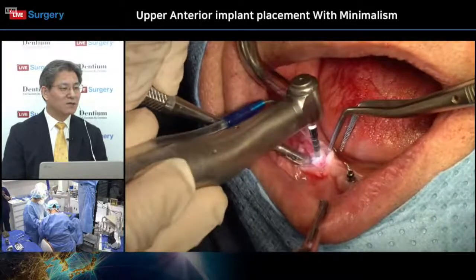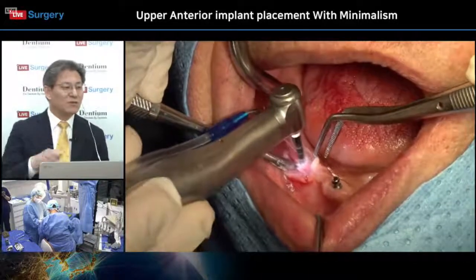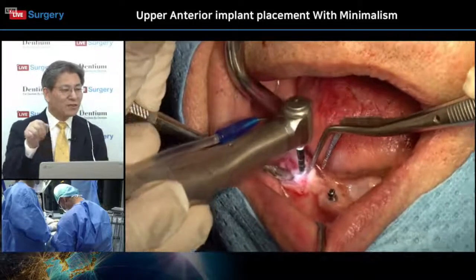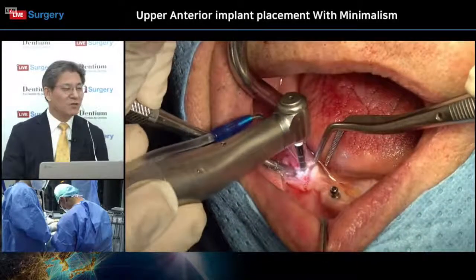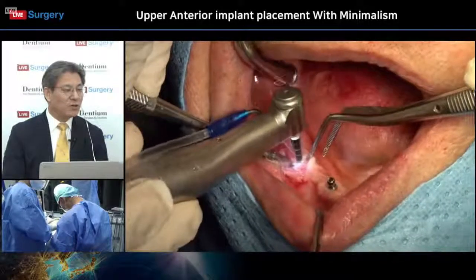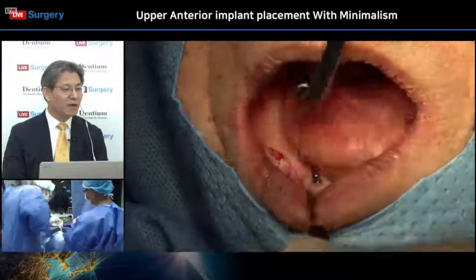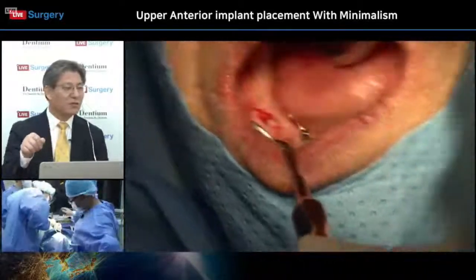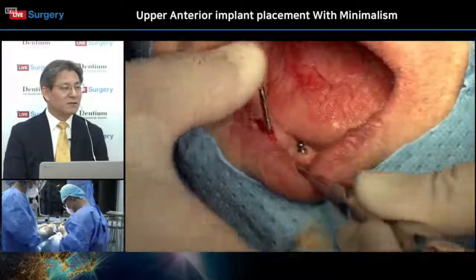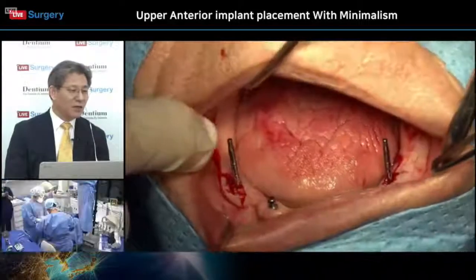So can you see the circular movement? Circular movement. So pay attention to this circular movement when using this Lindemann drill with a slower RPM with the saline irrigation. Yeah, the circular movement is very effective, like in a posterior mandible.